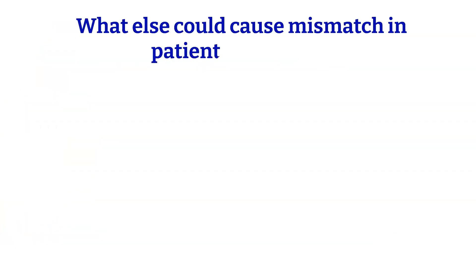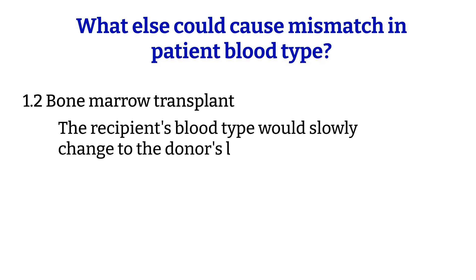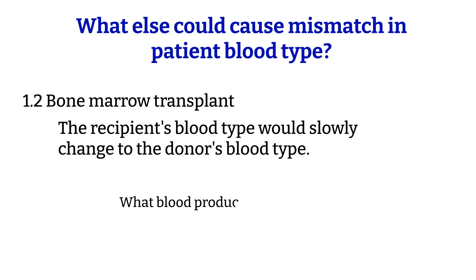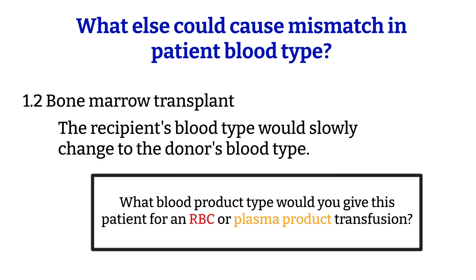Next is the bone marrow transplant patient — specifically in cases where the donor and recipient have different blood types. After a bone marrow transplant, the recipient would slowly change to the donor's blood type. During the transitional period, we could see unusual blood type results due to two red blood cell populations inside the patient. Think about what blood product type you would give these patients, whether RBCs or plasma products, and leave your answer in the comments.